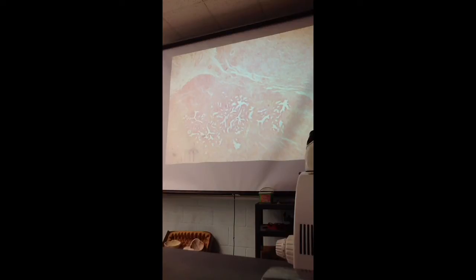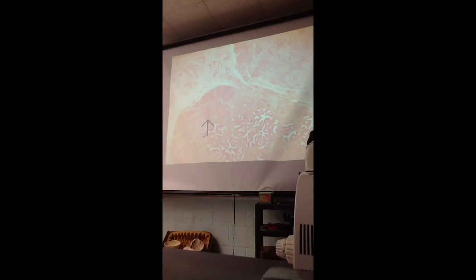The structure that you see is the seminal vesicle. The seminal vesicle is another accessory gland that contributes to the semen. It's just like a simple tube that's thrown into lots and lots of folds. So this is actually all one tube thrown into lots and lots of folds, and all these secretions are dumped into which structure? Ejaculatory duct.